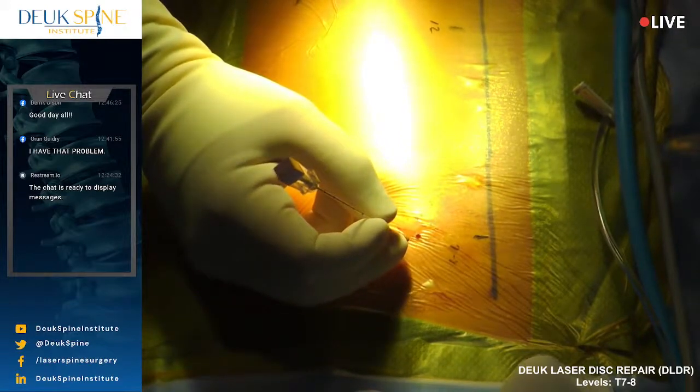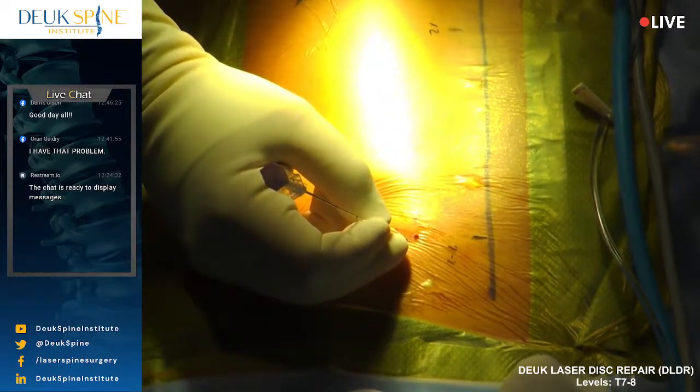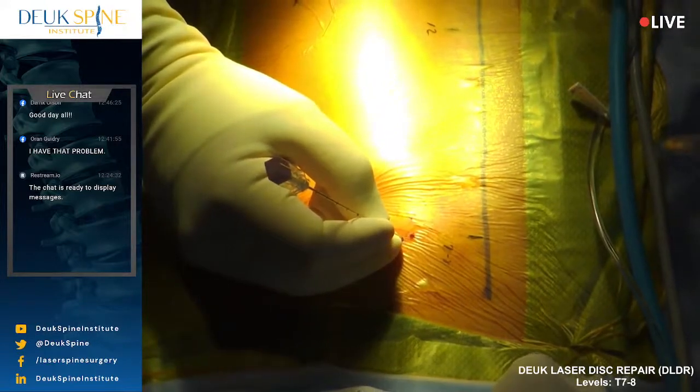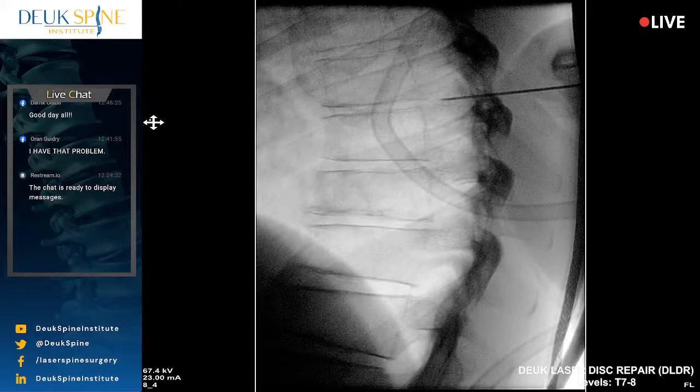Are you comfy? Yes. As much as you can be, right? For me poking on you. Shot, where do you feel that? Okay. Where'd you feel that? In the spine? Yeah. All right.